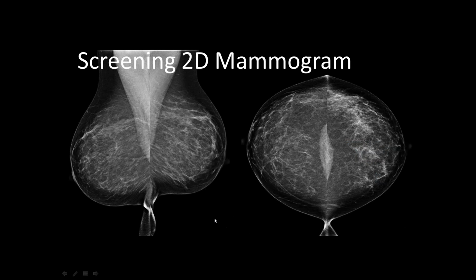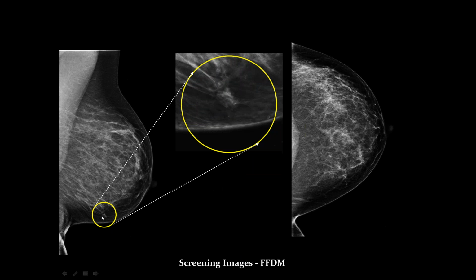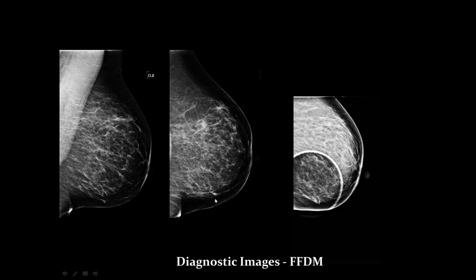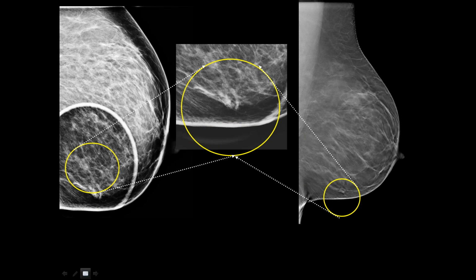This is an example of a patient that we didn't do a biopsy on, but on a screening mammogram, somebody identified a little nodular density in the inferior part of the left breast. And here it is magnified, and they couldn't find it on ultrasound, and they're working it up with compression spots and so forth, and actually they recommended a tomosynthesis prior to a consideration for stereotactic, and it's this area here.